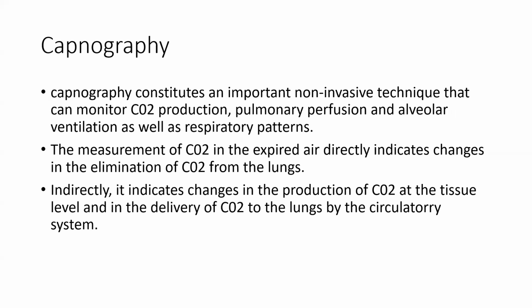respiratory pattern. The measurement of CO2 in expiratory air directly indicates the changes in the elimination of CO2 from the lungs. Indirectly, it indicates the changes in the production of CO2 at the tissue level and the delivery of CO2 to the lung by the circulatory system.